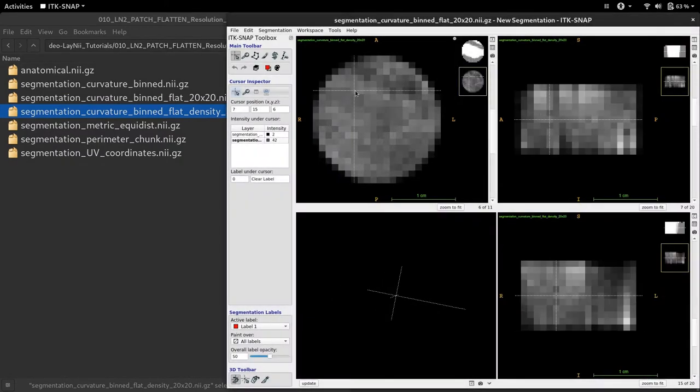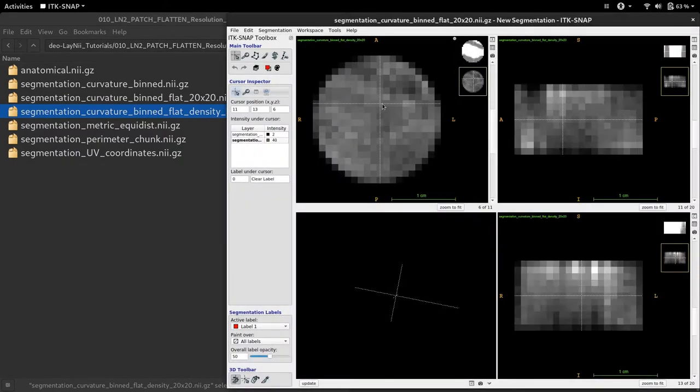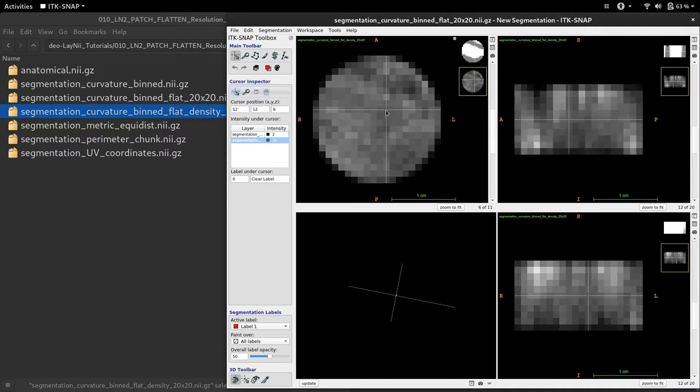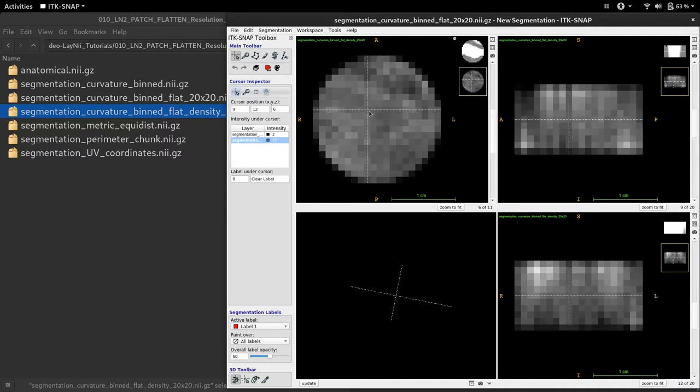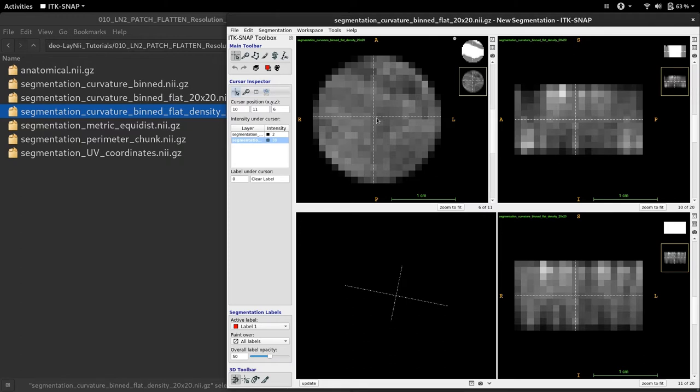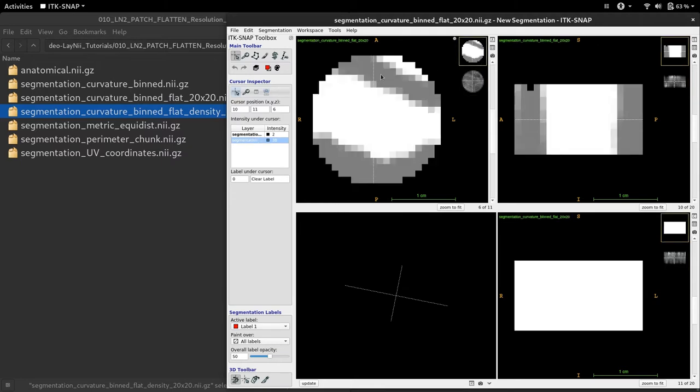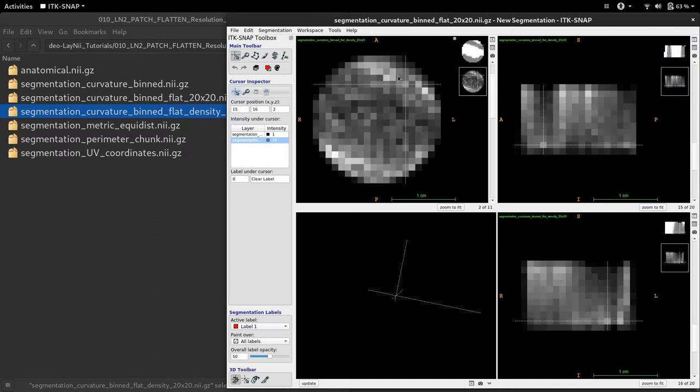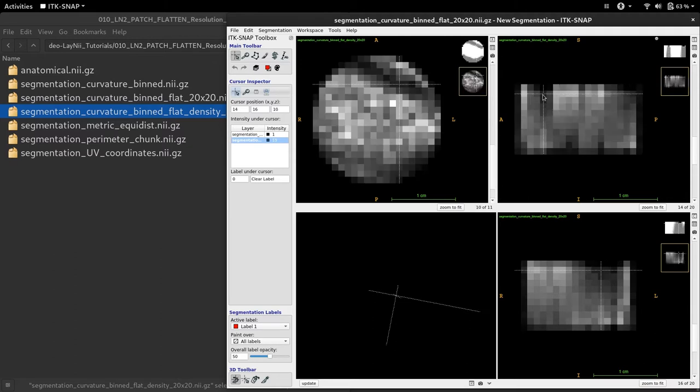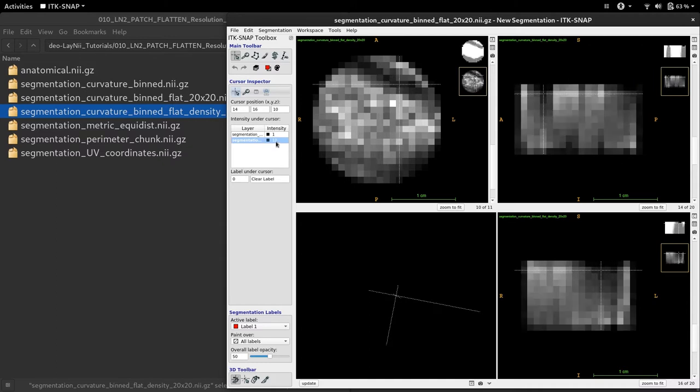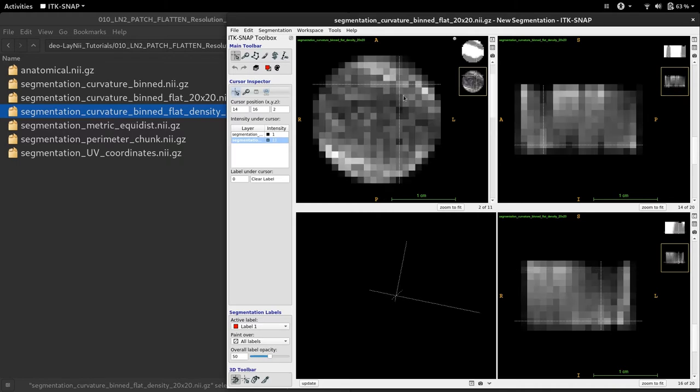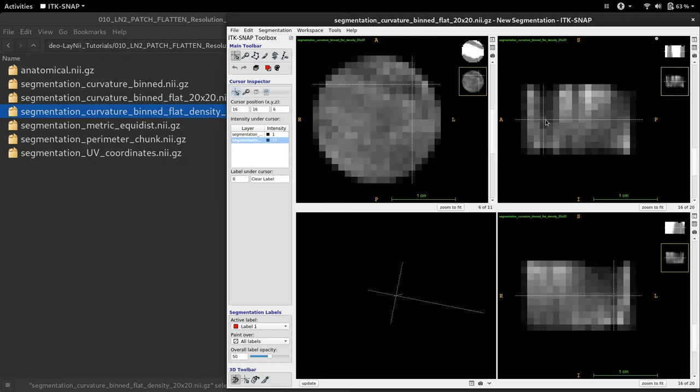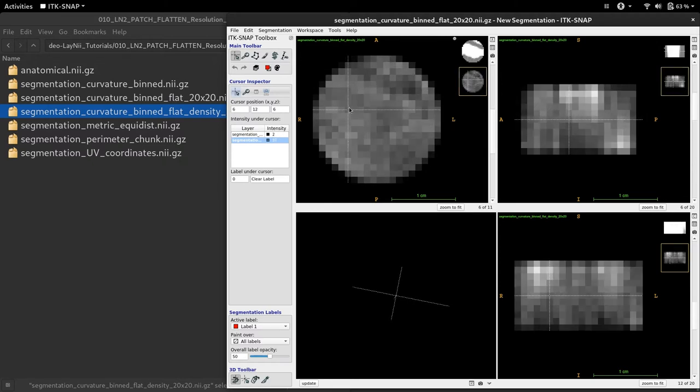In this density image, what you're seeing is the number of folded brain voxels that fall into this exact bin in the flat representation. You can see that this number varies. This is expected because you cannot change the curvature of an object without making some parts denser or sparser. You can see that in the sulcus part, in the deep regions of the gray matter, we have very dense sampling. However, in the superficial parts of the cortex, we have more sparse sampling. The density values decrease from tens in the deep regions, they increase to fifties, and in the middle of the gray matter they should be more or less homogenous.